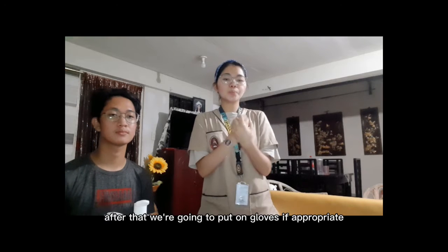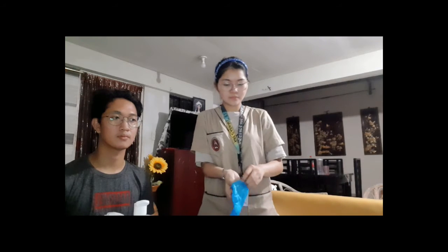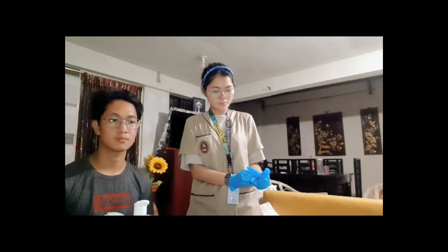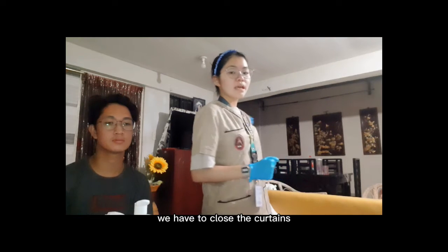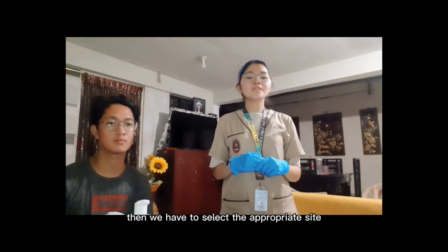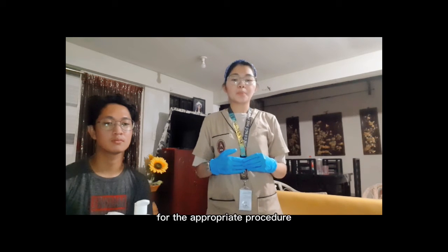After that, we're going to put on gloves if appropriate or indicated. Next, we have to provide client privacy. So, assuming that there are curtains, we have to close the curtains and close the door to the room if possible. Then we have to select the appropriate site and the type of thermometer for the appropriate procedure.